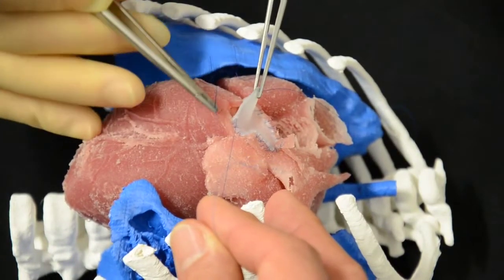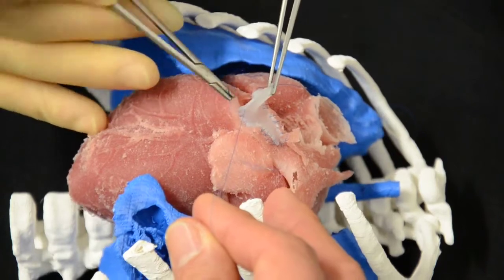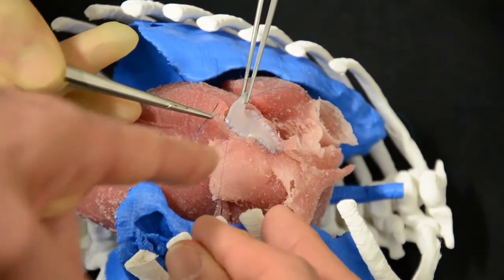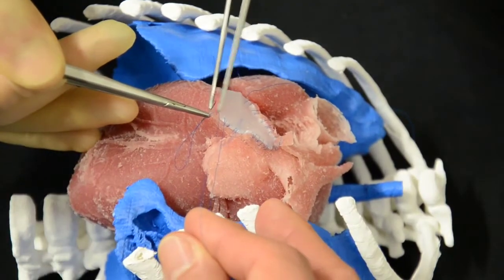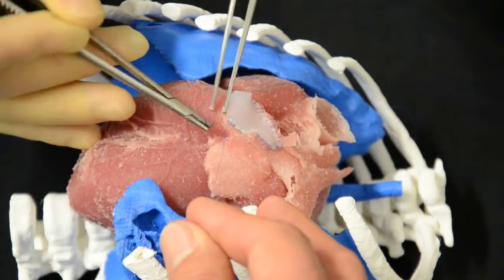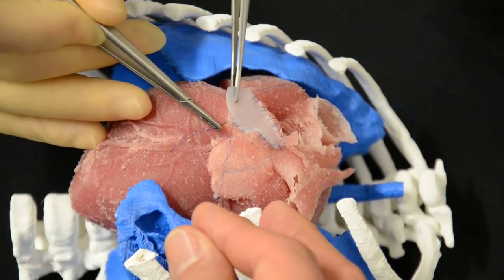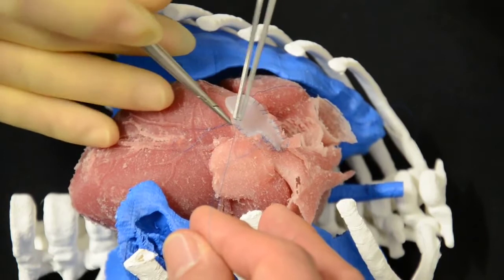If I do a stitch in a bad way — see, that's a bad stitch. You see how it's there? So if I do that in real life, you may bleed afterwards. That's why it's a really good advantage of this material — that's what we feel makes it valuable for simulation.